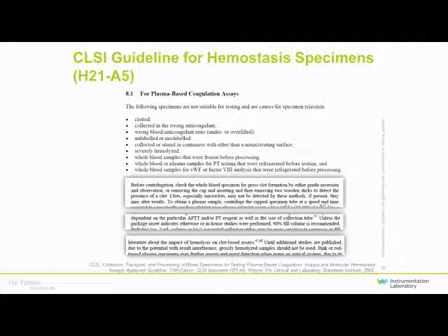So specifically to dive into the ones that we're going to discuss today, clotted samples. Clots, especially microclots, may not be detected by the current methods that people are using, including gentle inversion or the stick method. That is a limitation that we currently have in the laboratory. The other thing is 90% of the fill volume is recommended, and that is currently a clear recommendation. And the last being that grossly hemolyzed samples should not be used, but there is no qualification of what grossly hemolyzed is or what that equates to.